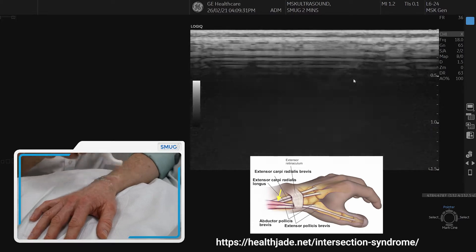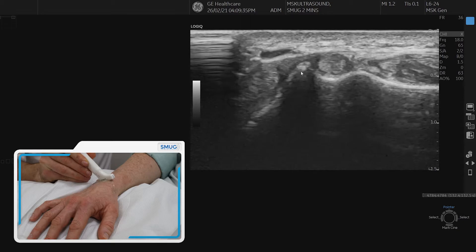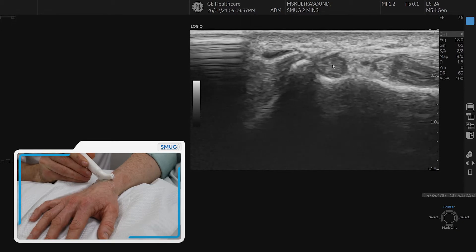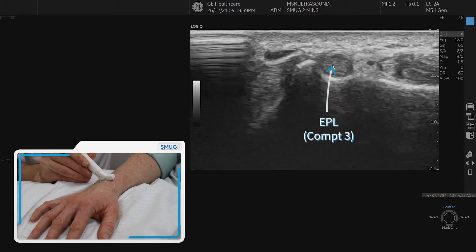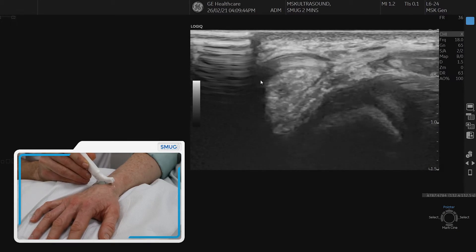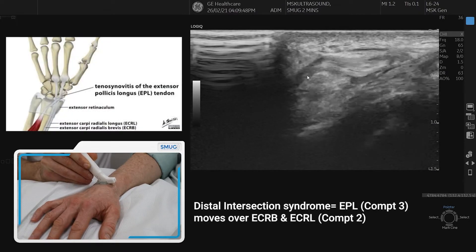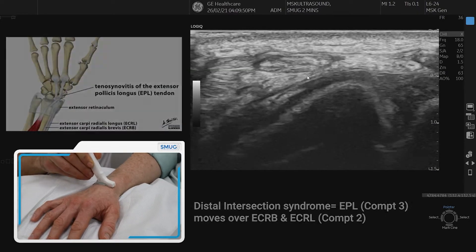The second is the more distal intersection syndrome. If we find Lister's tubercle you can see EPL there, and if we follow EPL down you'll see that extensor compartment three — which is EPL — goes over extensor compartment two, and that's where you can get this distal intersection syndrome.